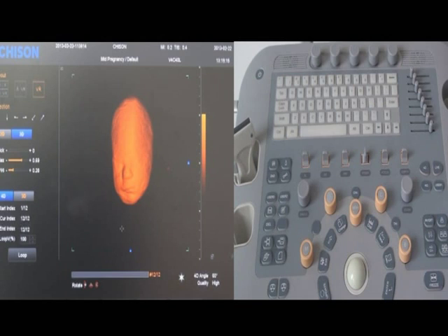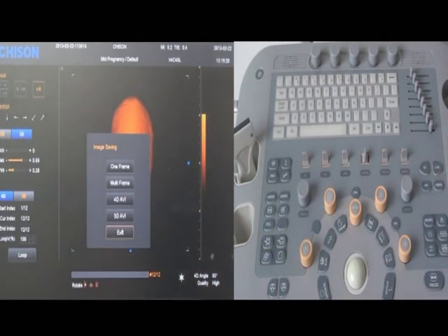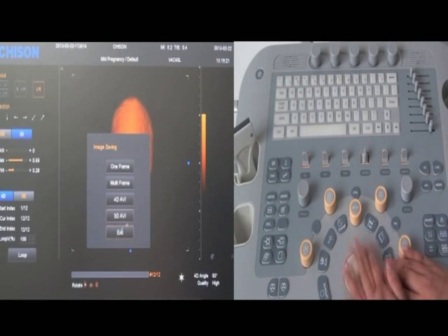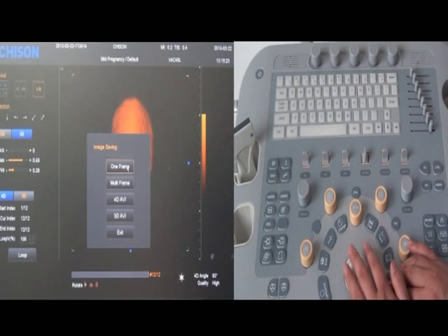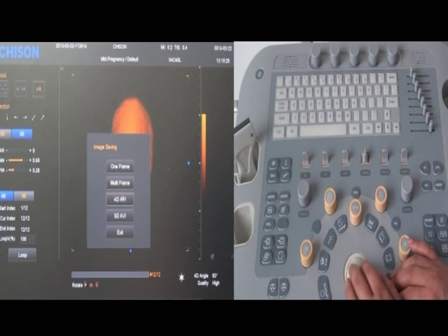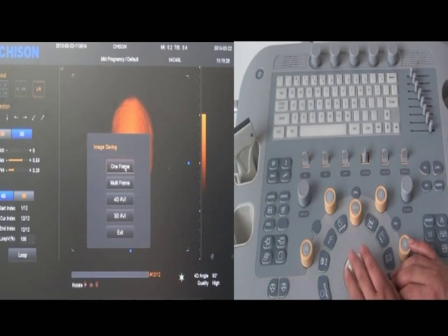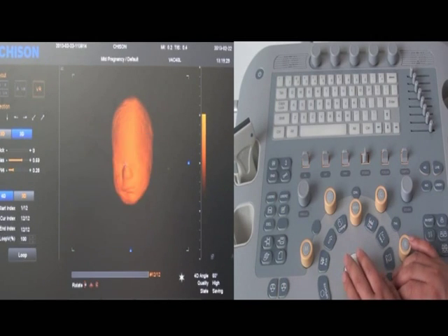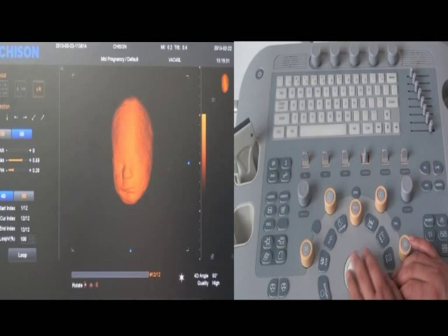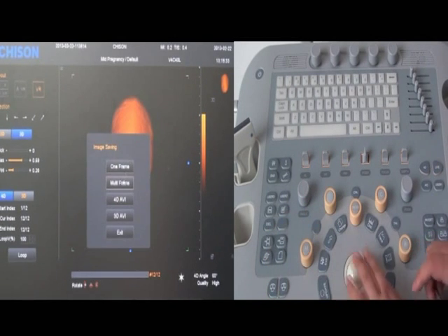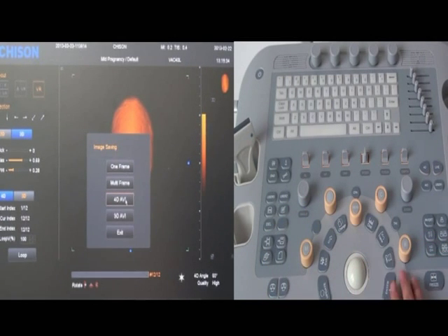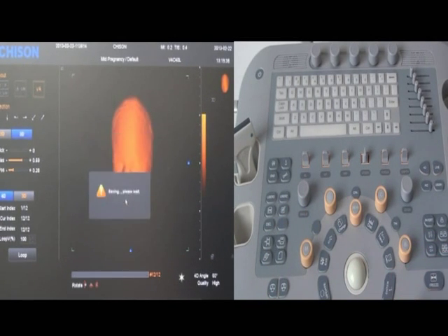After you get a good 4D image, you can save the images. Press the save key and choose the format. We have one frame, multi frames, 4D AVI, and 3D AVI. If you choose one frame, you can save a single image. If you choose 4D AVI, you will get a cine movie. Wait a few seconds for the process to complete.